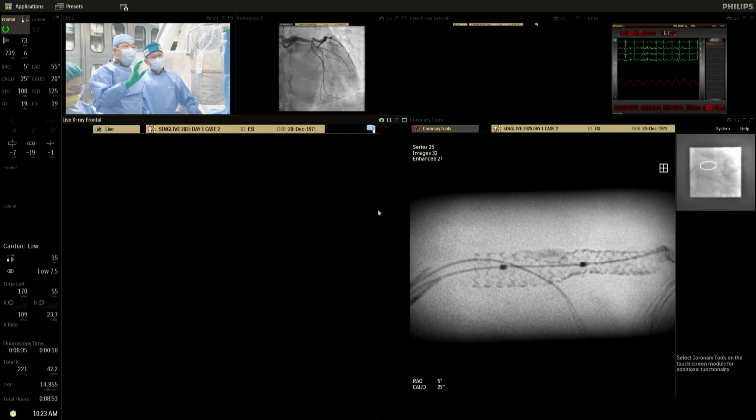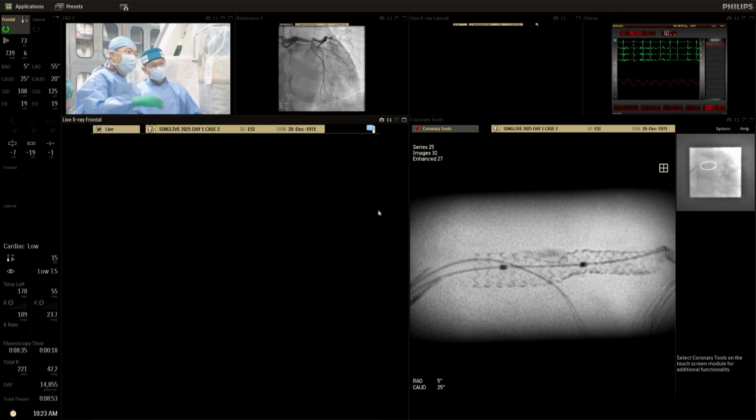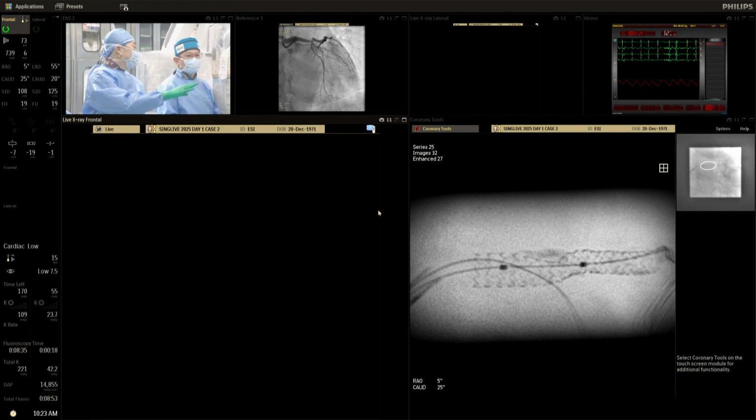Sorry, just to stop the discussion. Can you see the StentBoost picture? Obviously there is quite bad calcification. This is really quite outside the wall, and even rotablation may have difficulties getting this calcium. It also looks very eccentric, so IVL may or may not work in this situation.